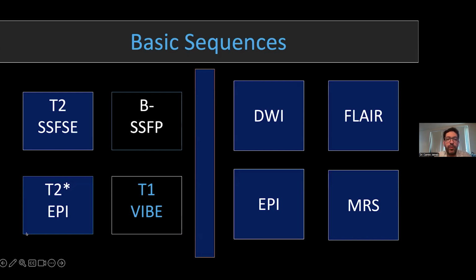I always do a T2 star or EPI image to look for blood products and a T1 gradient echo or T1 VIBE or LAVA just to get a little bit of T1 contrast. I think the T1 contrast is nice to have in the brain, but fundamental in the body to look at the liver, the meconium, and a number of other things. So I will definitely keep it there, but I think it's higher yield in the body. There are other ways of doing T1 imaging in the fetus. There are some single shot inversion recovery sequences. They work nicely. However, I favor this just because for me, it's always turned out to be fairly reliable and easy. But there are definitely some spin echo based techniques that work nicely.